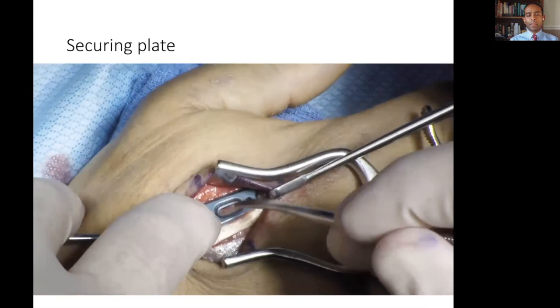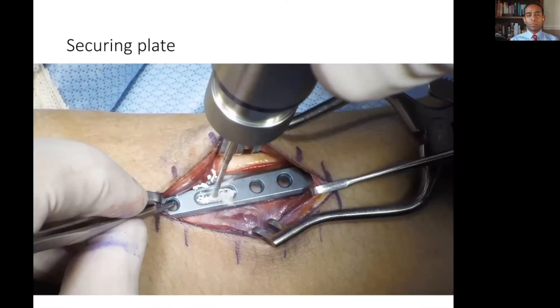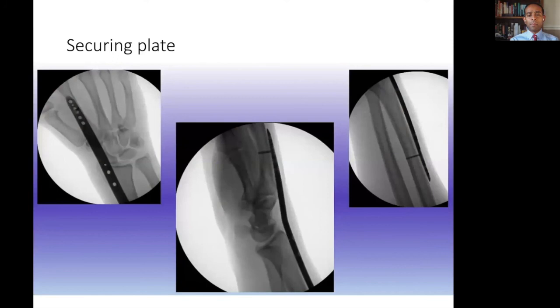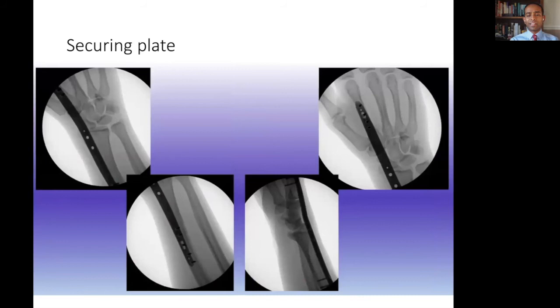Next, care is taken to ensure the plate is central on the metacarpal before being secured with a non-locking screw. This seats the plate well to the metacarpal, and the same can be done on the shaft of the radius. Position can once again be checked with fluoroscopy. Once all is adequate and sufficient traction is performed, locking screws can be used to stabilise proximally and distally, and radiographs taken to check the desired effect has occurred.